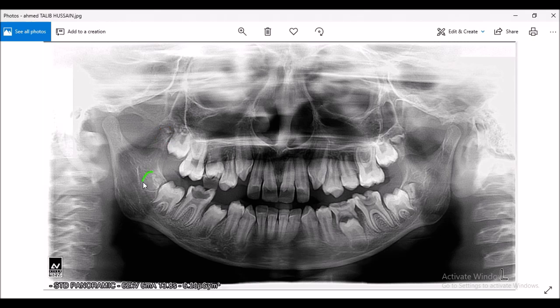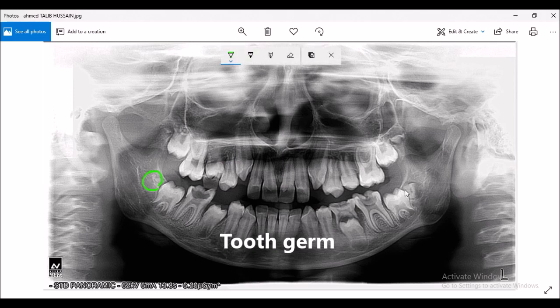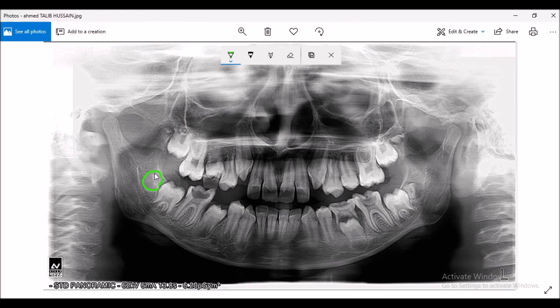This is the developing tooth germ. Same over here — you can see the pointer. These are the developing tooth germs, or more precisely, the developing tooth germs of the mandibular third molars, also known as the wisdom teeth.